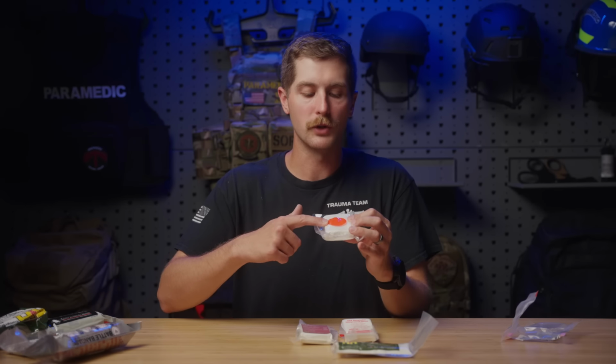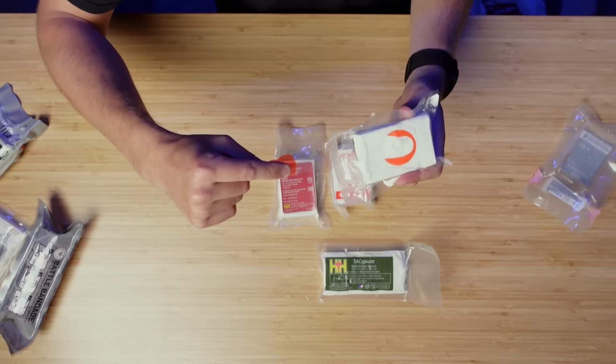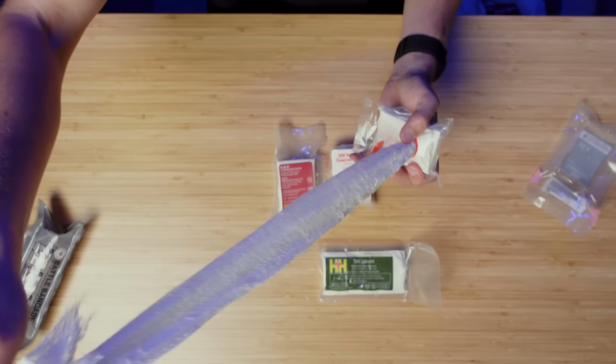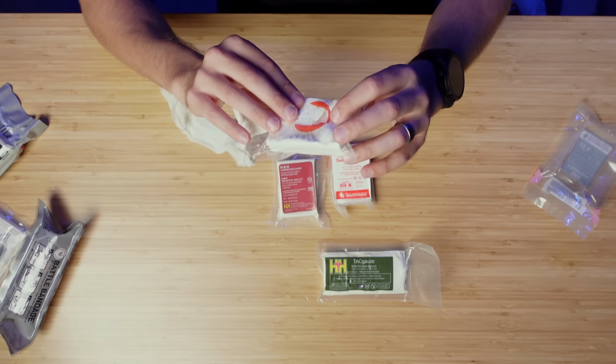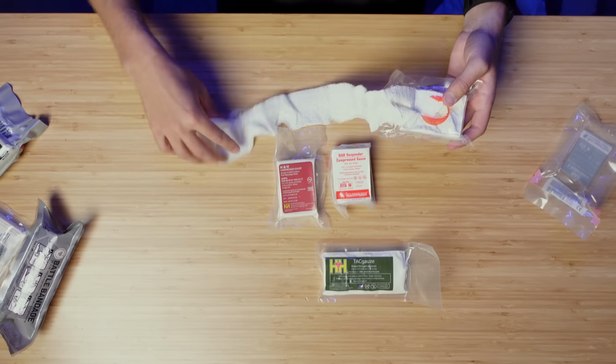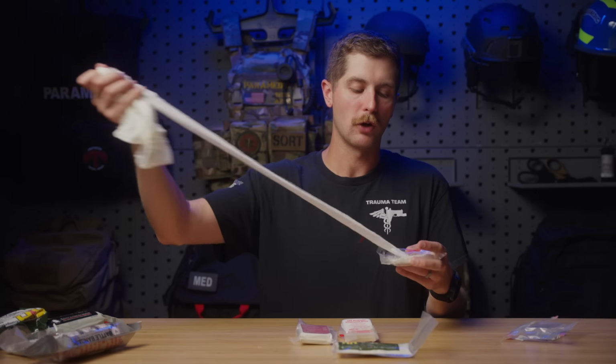So like I just said, if it's red on North American products, it's going to open, not dissimilar to Striker Cut. So here, I can take this, I can rake that section back, and now I can pull this gauze out a little bit at a time. And the thought is that then this isn't falling in the mud and somebody's blood getting saturated before you even pack the wound. You know, it works. And then you can just pull this all the way off.